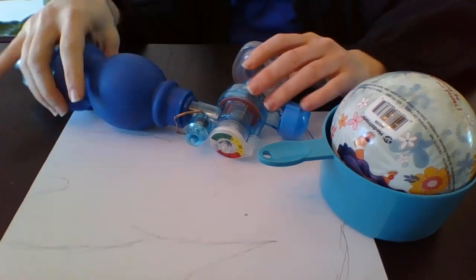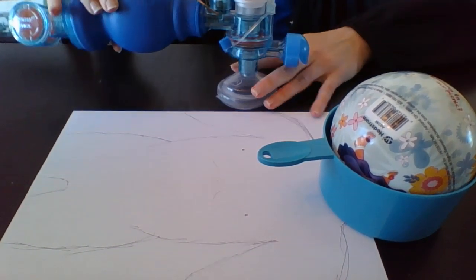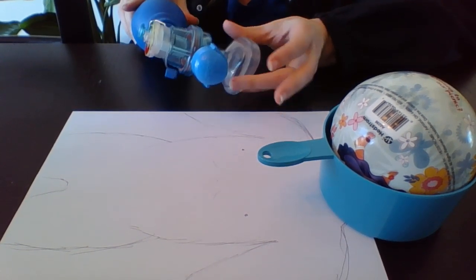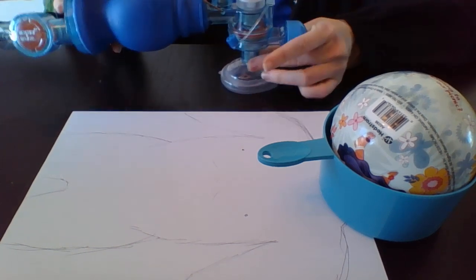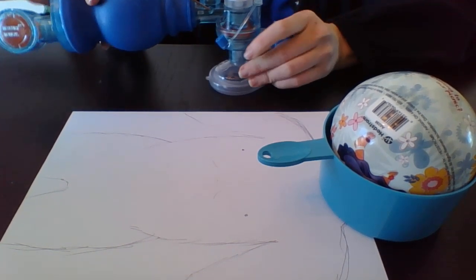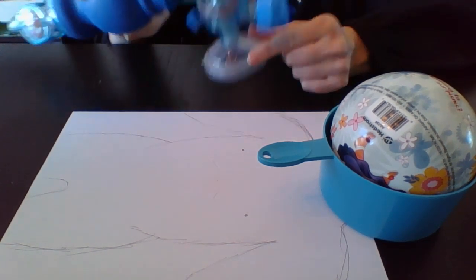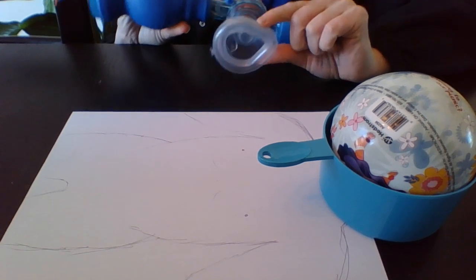This is the bag that you'd be looking at using, typically speaking, with the mask on here. I'm not working with a preemie mask, just a regular sized newborn mask, assuming that we won't be dealing with a preemie in this scenario. And you want the smaller end up over the nose, over the nose, down, and just at the chin level. So that's where this mask should be sitting on the baby.